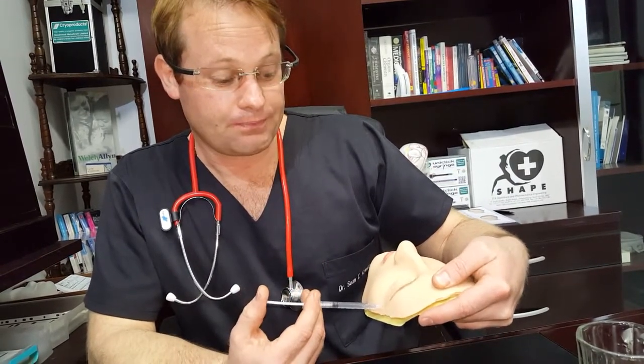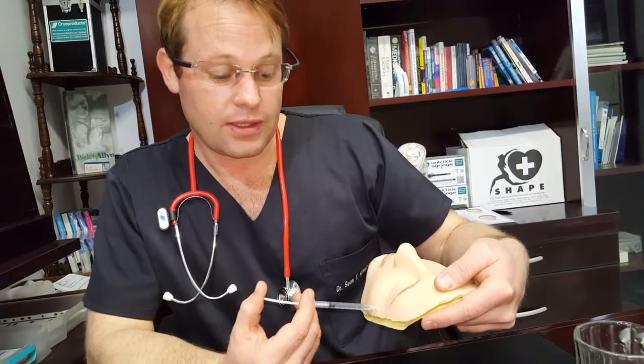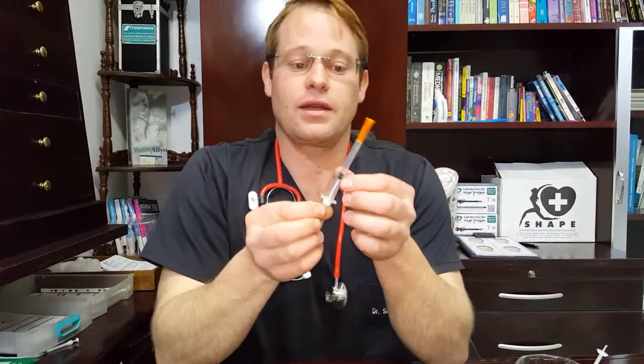Also, to prevent the unnecessary time of titrating a drug such as adrenaline or other highly potent drugs, you can use the UniClick to your advantage — draw up the entire ampoule of adrenaline, for example, and have your dose regulation to the T with a single click.